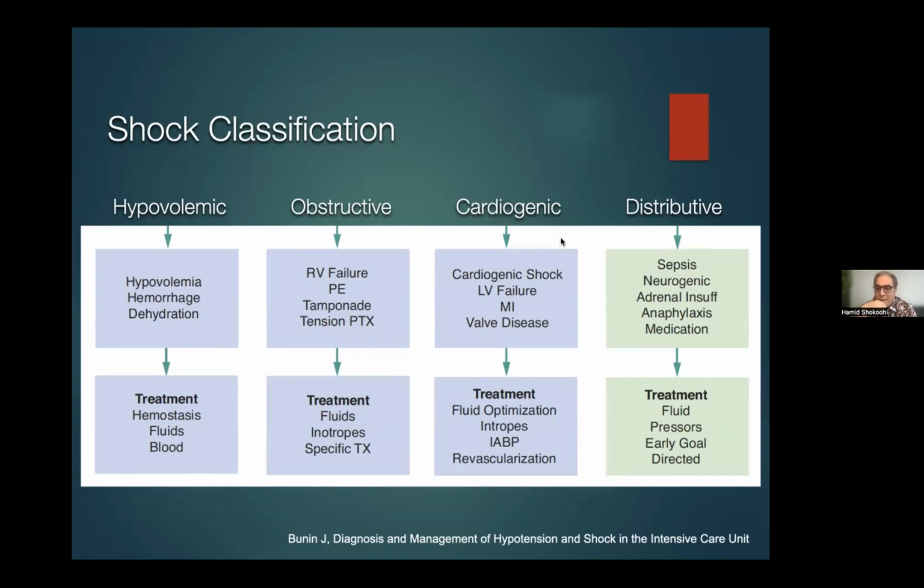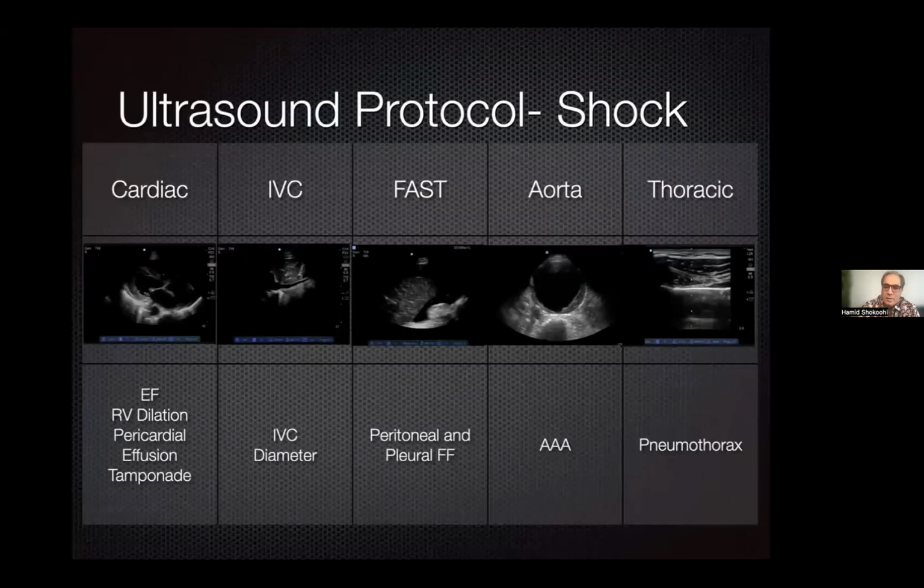These are the ones where the treatment is much different from what you want to do with hypovolemia, which we'll talk about in a second. So I could put this all in the shock protocol. As you can see, we do not know the obvious reason for shock in this case. Basically, we are dealing with undifferentiated shock and undifferentiated hypotension.